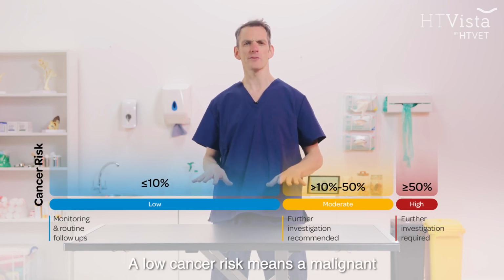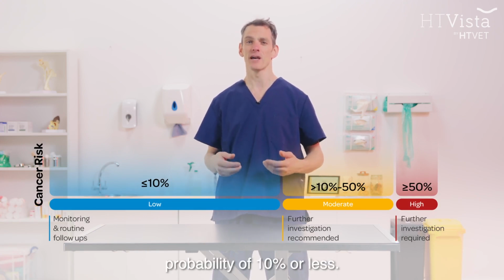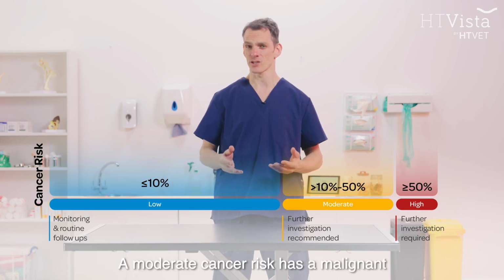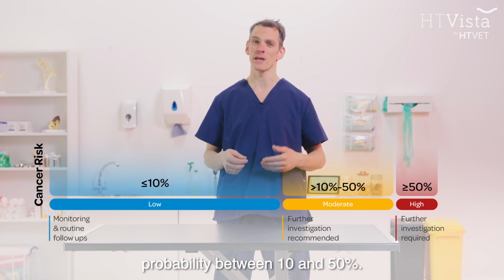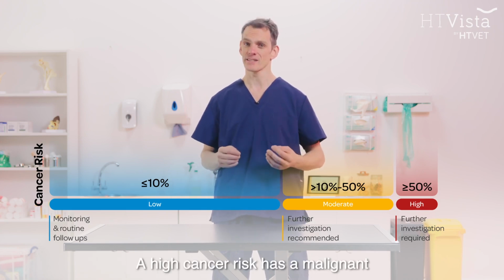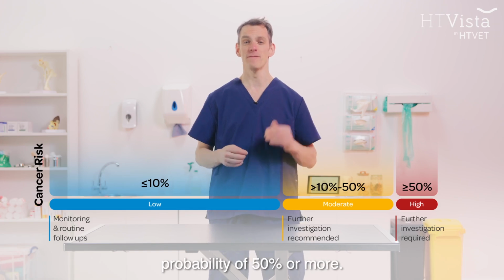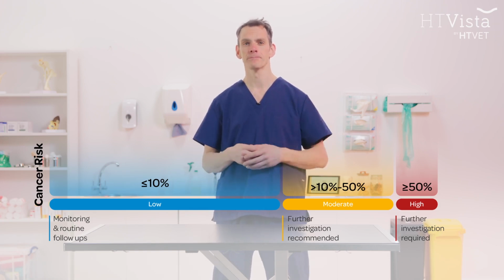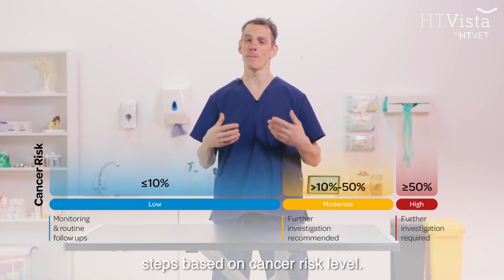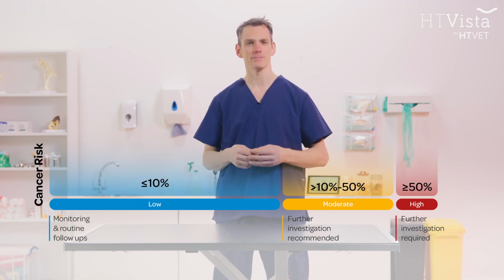A low cancer risk means a malignant probability of 10% or less. A moderate cancer risk has a malignant probability between 10 and 50%. A high cancer risk has a malignant probability of 50% or more. So for each of these results, there are different recommended next steps based on cancer risk level.